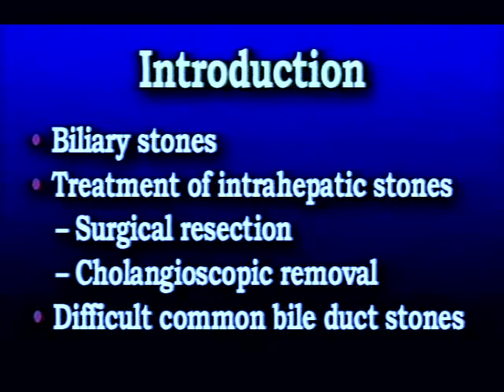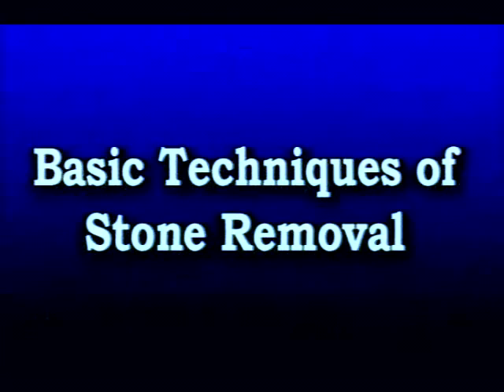However, in a patient with multiple bilateral intrahepatic stones, cholangioscopic stone removal can be a good therapeutic option. The cholangioscopic approach can also be applied to difficult common bile duct stones which are not removable by the conventional duodenoscopic approach. Today, I'd like to provide you a series of videos showing several techniques of cholangioscopic stone removal. Let's start with the basic techniques of stone removal from the bile duct.